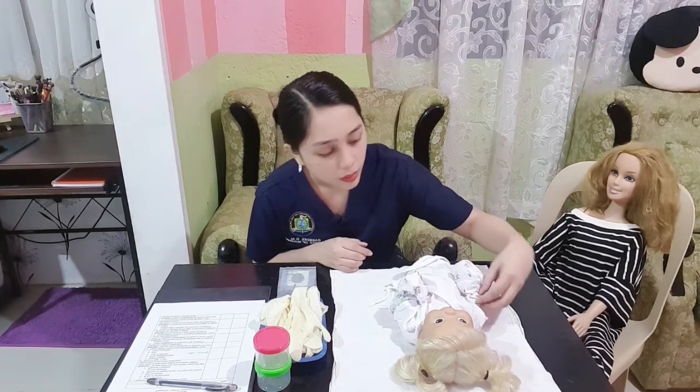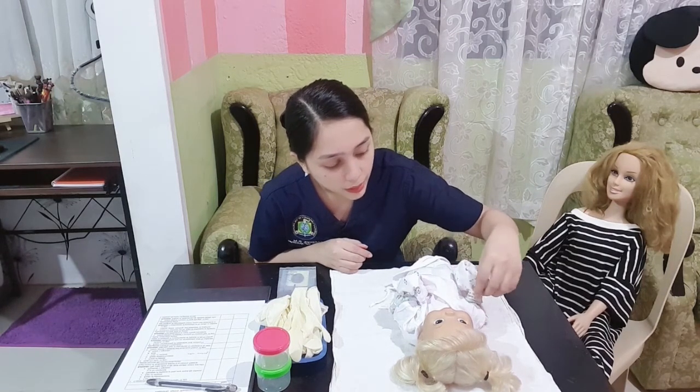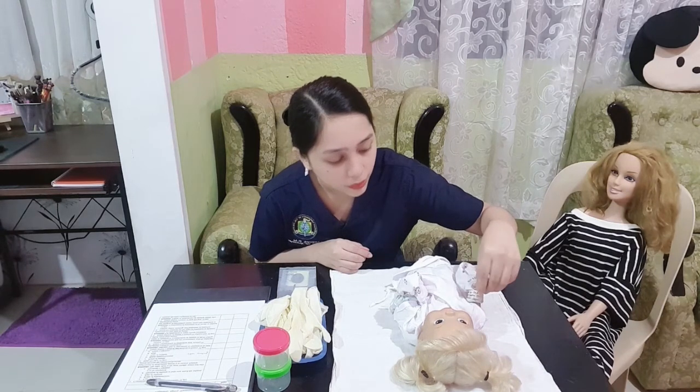Then, identify the client. Here I will be checking the identification band, which consists of the name, birth date, and or medical identification number. Rationale: identifying patients accurately and matching the patient identity with the correct treatment or service is a critical factor of patient safety. To prevent instances of misidentifications and near misses, the Joint Commission requires that two identifiers, such as patient's full name, date of birth, and or medical identification number, be used for every patient encounter.